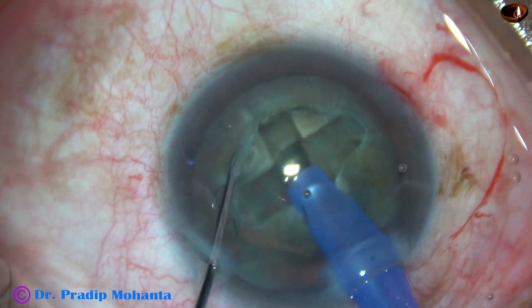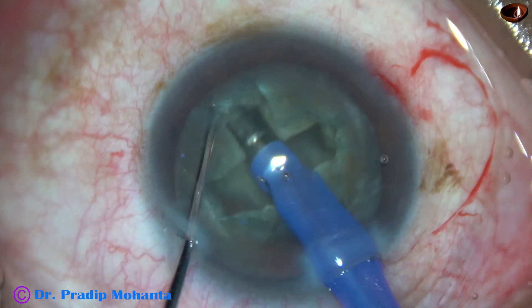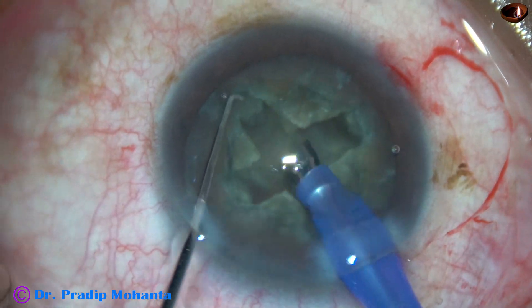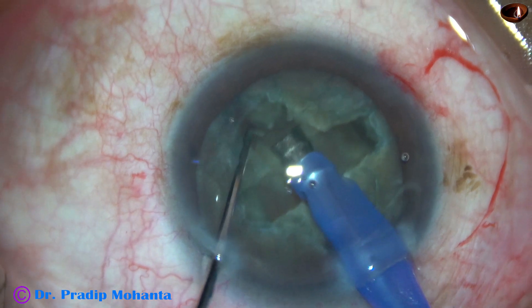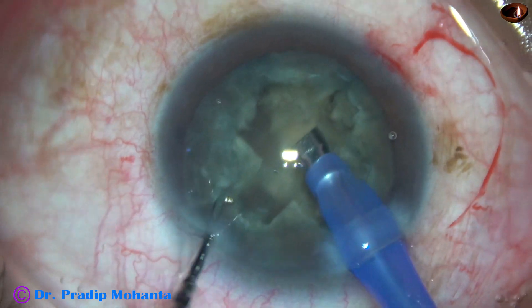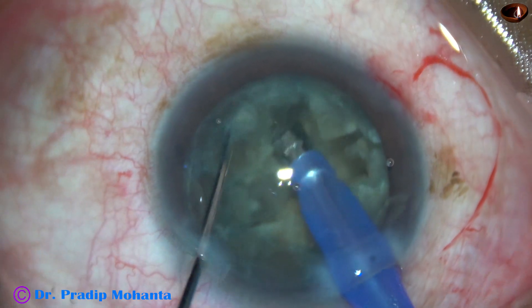Particularly the central hard part of the nucleus has to be removed. For that we may have to work for a while. But this is a safe technique, and beginners should always start with this technique. This is the first crack by opposing forces. This is the second crack, and a small free nuclear fragment is there. And this is another crack. And this is the fourth crack.